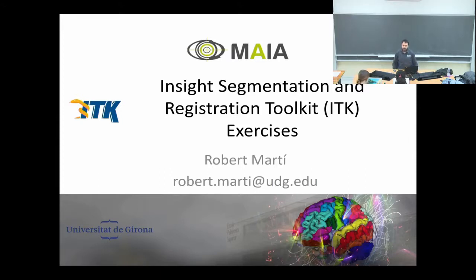Okay, so we will start the second session on ITK. We started yesterday, hopefully installing and running the Hello World example. All right? So today, well, first I would like to check if everybody has been able to download, install ITK and run the Hello World example, and then if everything works, then we'll move forward with doing some examples on input, output, and filtering. Okay? That will be the idea of today's class.